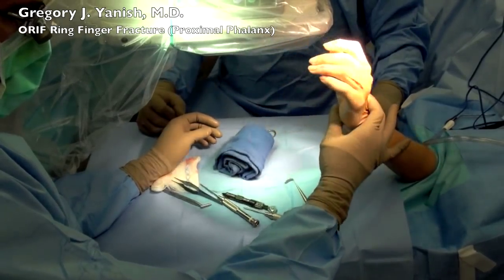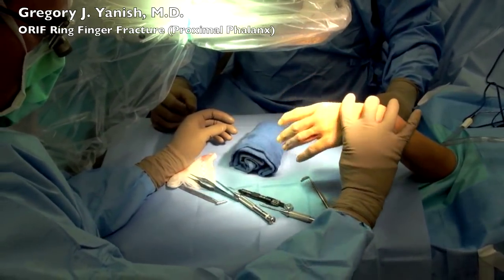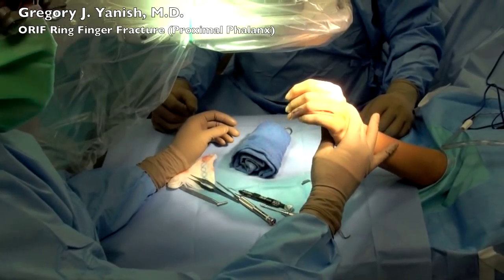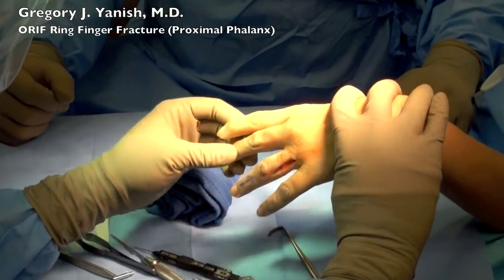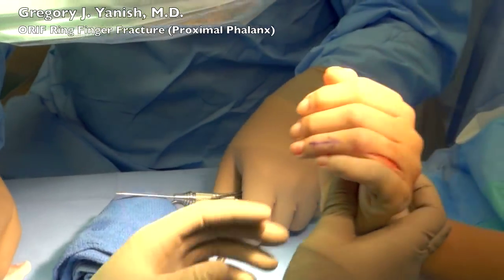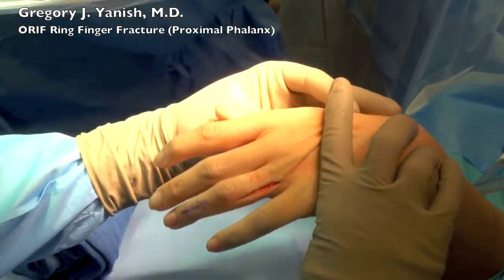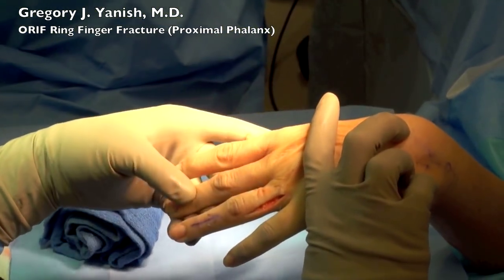At this point I'm going to check for alignment of the fingers. I'm doing a technique called tenodesis which allows the fingers to move through their normal relaxed anatomical arc, and I'm making sure that the ring finger does not scissor over the middle or the small finger. It's very well aligned and we take some time to confirm the alignment before we proceed.